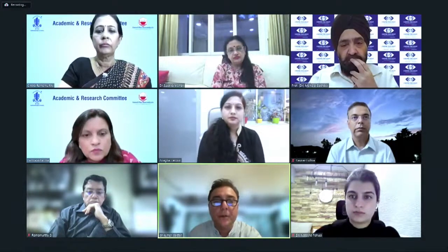Can I say something? Yes, Kumar. So one thing, Sujata, excellent video. Only thing was that in today's era, sometimes, if these are referred patients, we would like to do an OCT cornea to know the thickness of the flap.